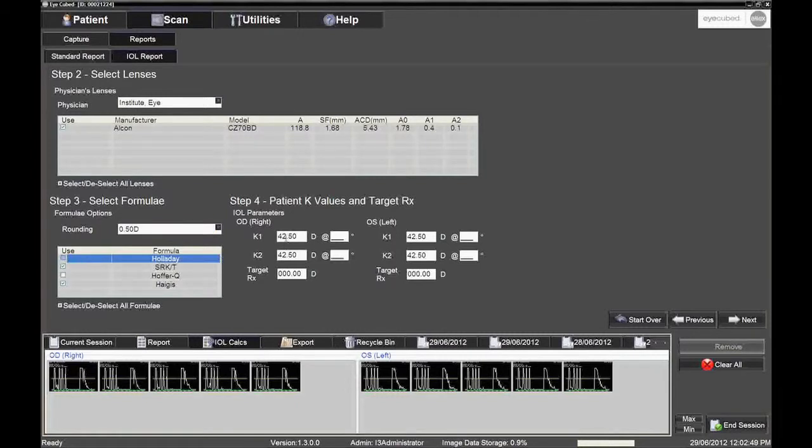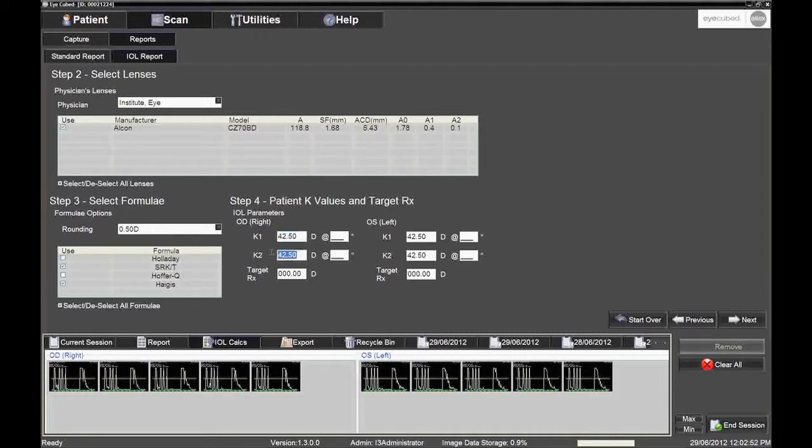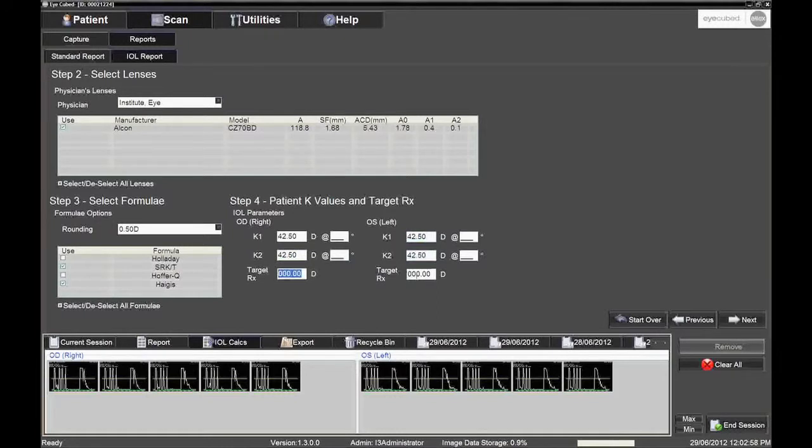Step 4. Keratometry values can be verified and changed here if needed. The post-op target refraction can also be entered. Click the Next button.